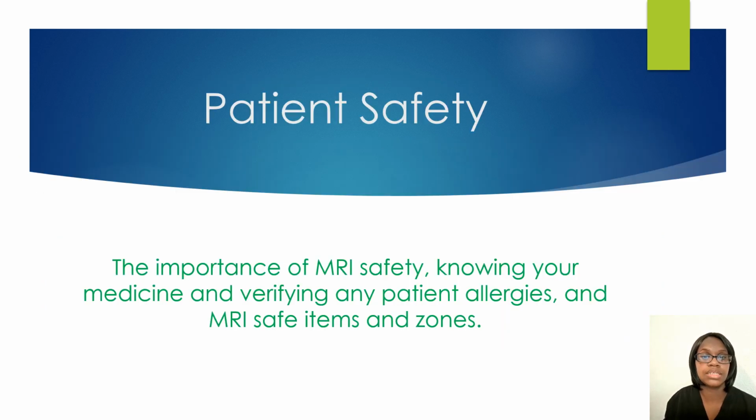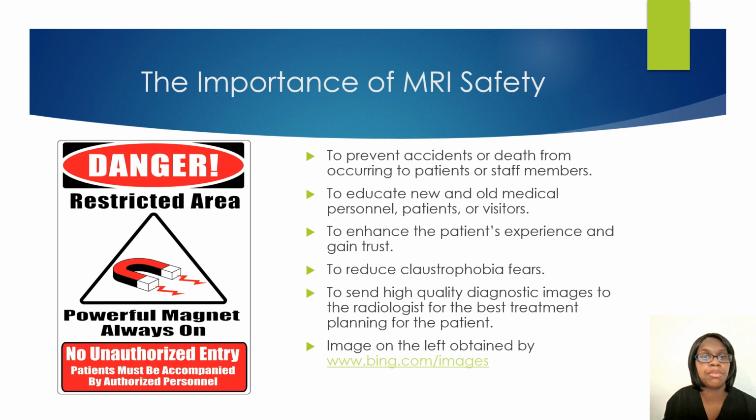All right, in this section, let's talk about patient safety. We're going to talk about the importance of MRI safety, knowing your medicine, and verifying any patient allergies and MRI safe items and zones. The importance of MRI safety. This is going to be to prevent accidents or death from occurring to patients or staff members, to educate new and old medical personnel, patients, and visitors, to enhance the patient's experience and gain trust, to reduce claustrophobia fears, to send high quality diagnostic images to the radiologist for the best treatment and planning for the patient.